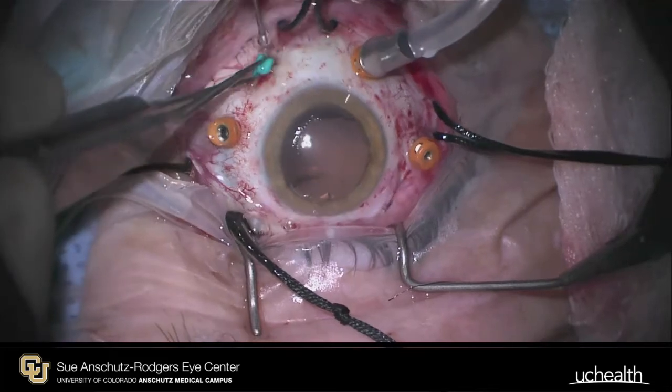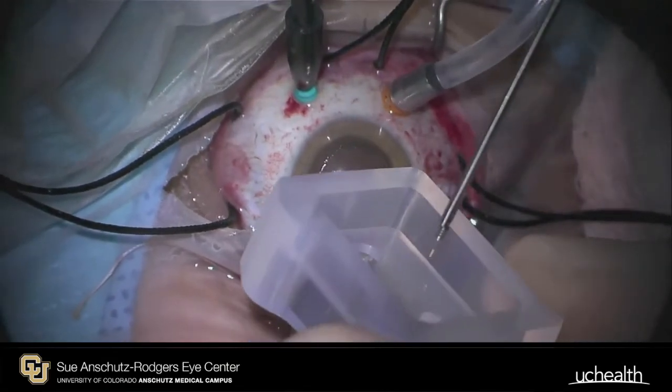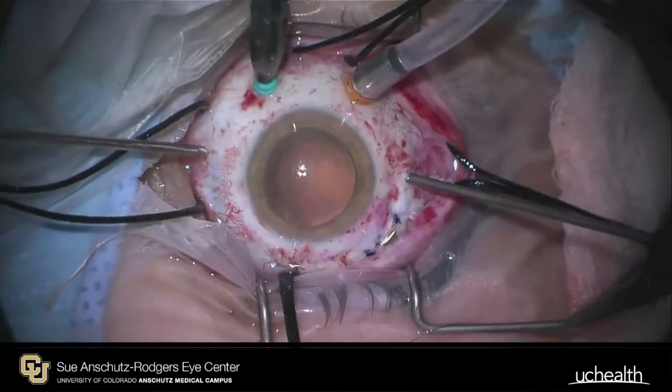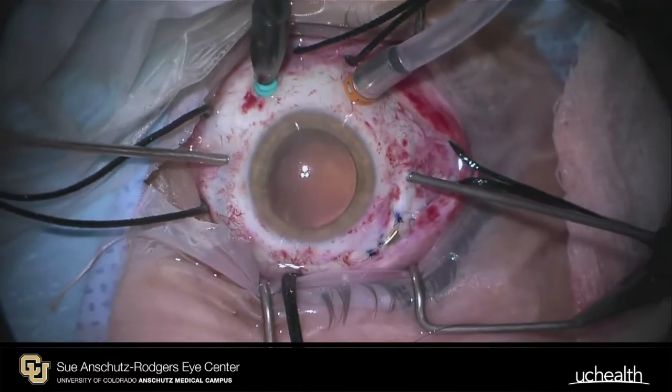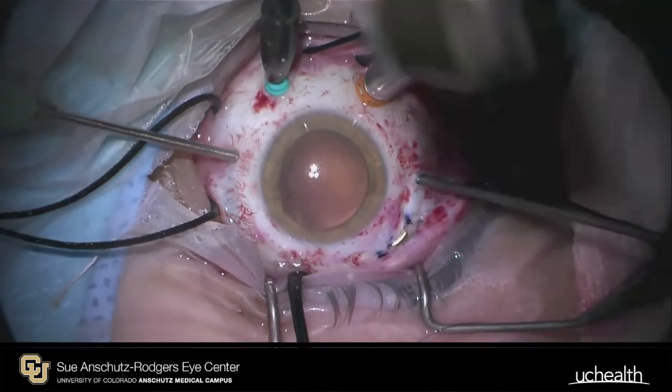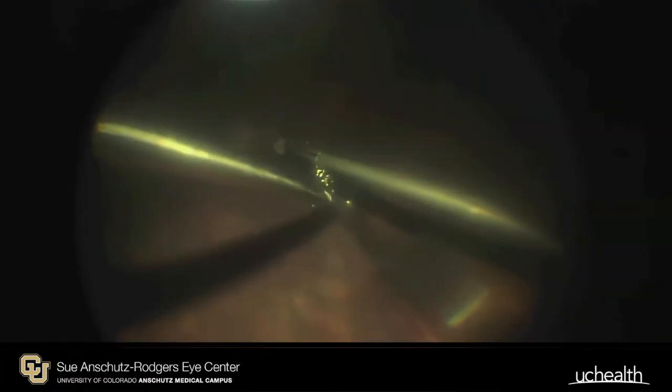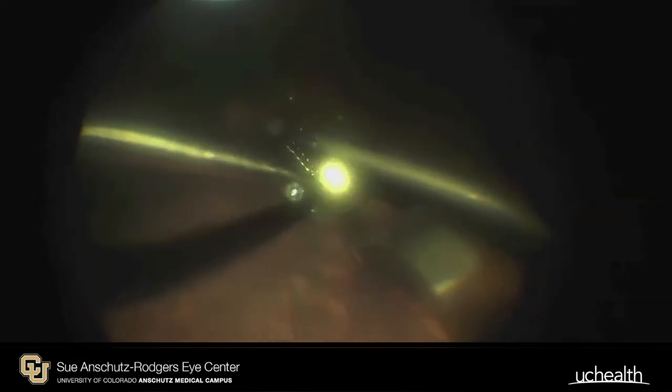An additional trocar is placed to allow for chandelier illumination. The electrode is gently placed on the macula in an appropriate position. The specialized tack insertion tool is used to remove it from the tack block. The tack is then advanced through an open sclerotomy into the vitreous cavity. Forceps are used to fixate the electrode array while the tack is advanced first through the fixation eyelet in the electrode array and then through the retina and sclera.